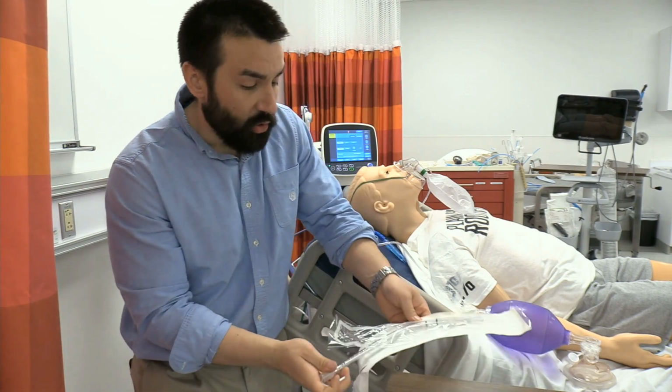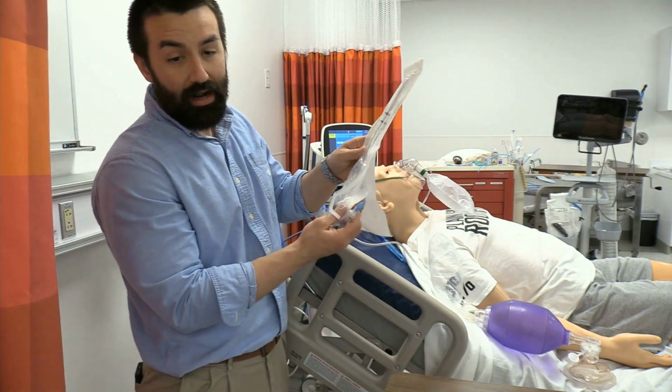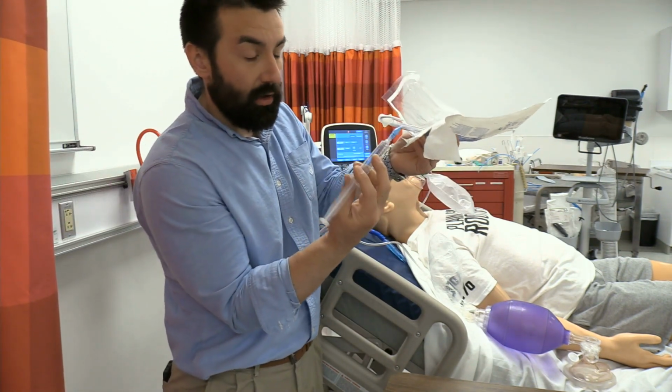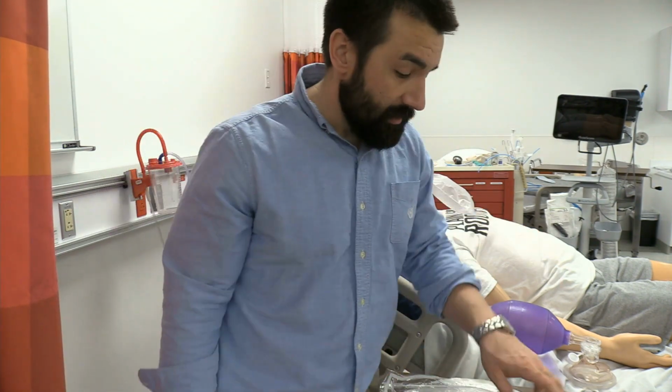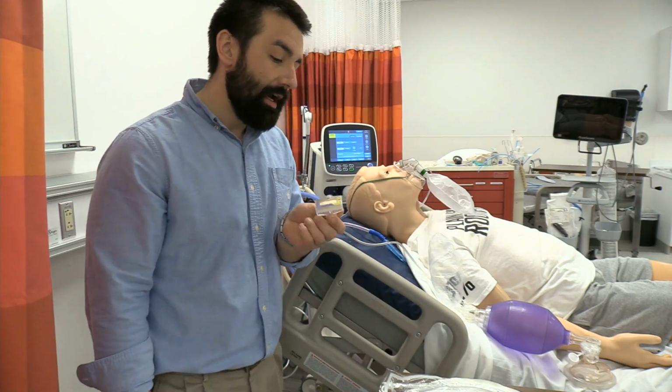Because this thing's covered in lube, and because I'm putting it in their trachea, even though it's going through their mouth and it's not sterile, I like to leave it in the package and ready to go. I also leave the syringe with air drawn back, hooked to the pilot balloon, ready to roll. I already got my resuscitator, and we talked about that. I'm going to need some means of CO2 detection to confirm we're actually in the trachea.